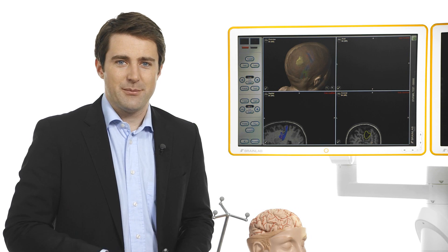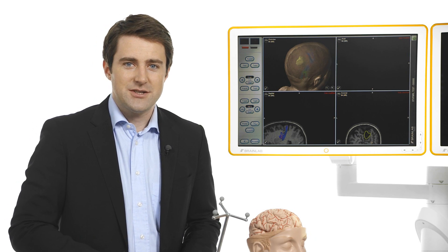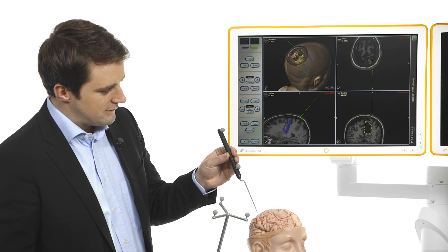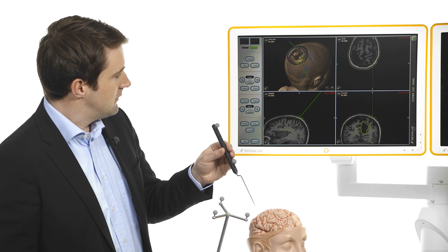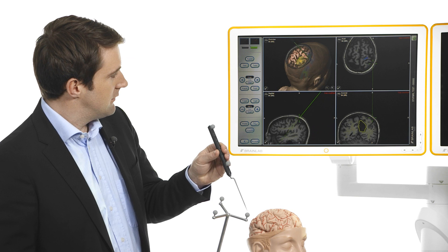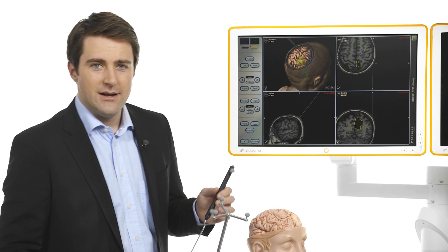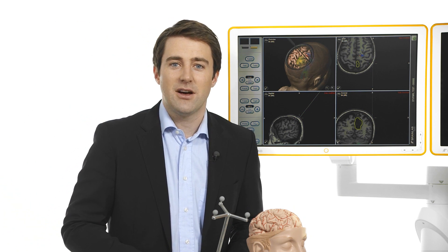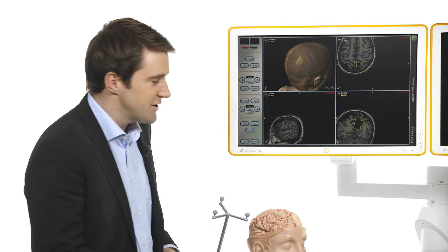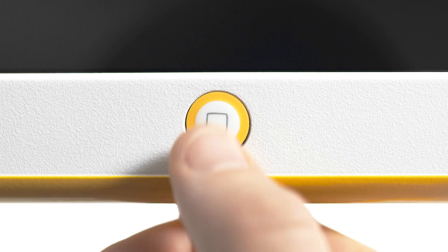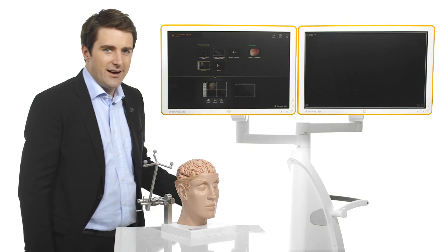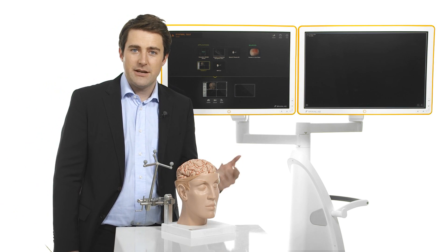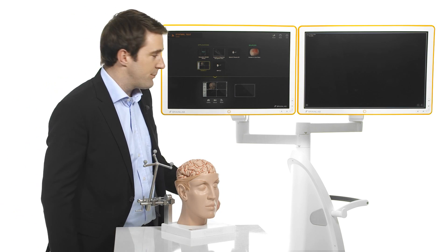After registering the patient, the images update in real time. Now I can incorporate the second monitor to take advantage of the software's multi-functionality. I can extend the navigation view, for example, with a three-dimensional probe's eye perspective.